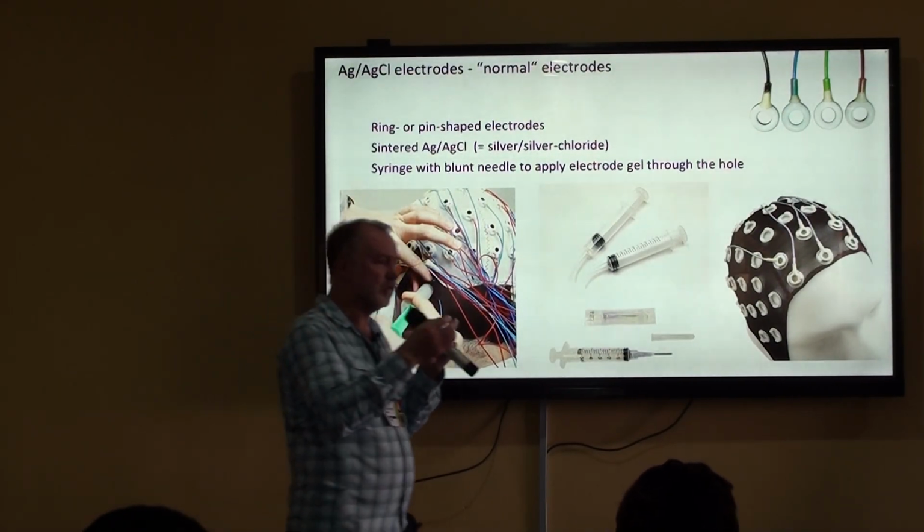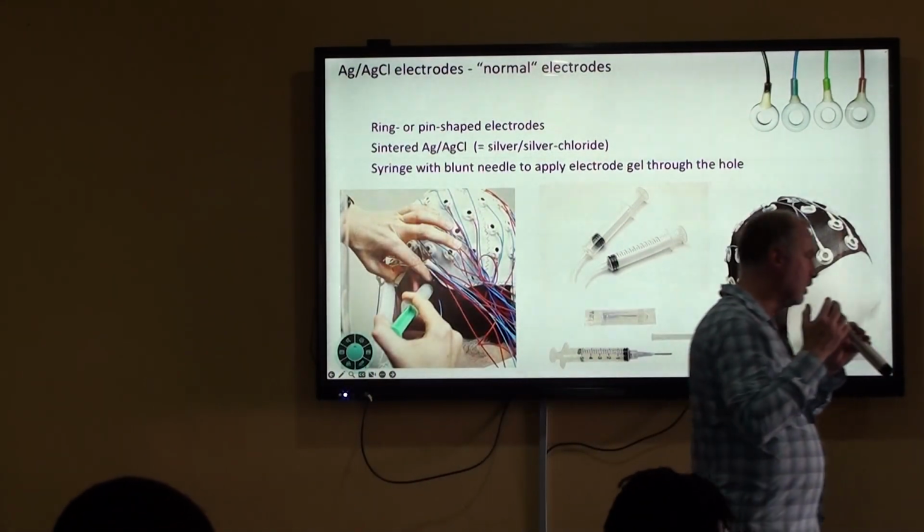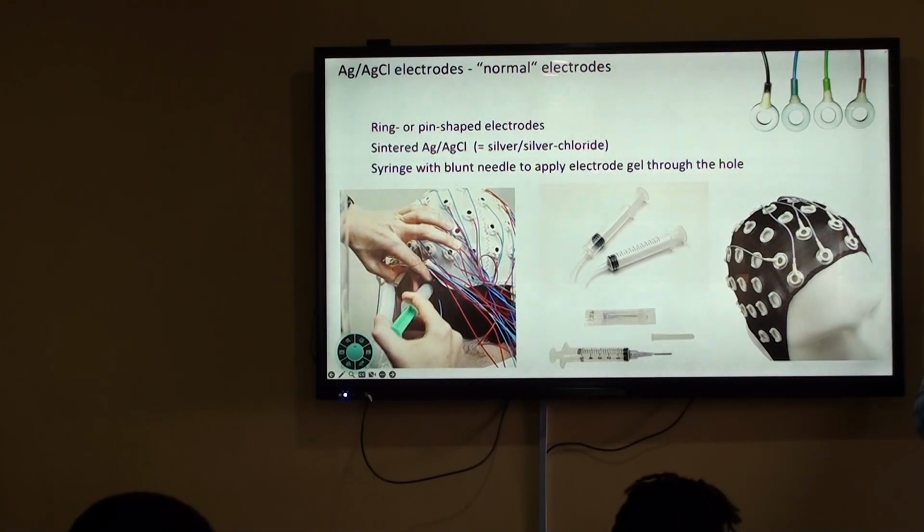So about the size of the caps, you mean? Yes, the design. I'm not sure whether there are specifically African design caps. I'm also not really sure whether there are differences in head dimensions between Africans and Europeans. I know that there are special caps for Asian people. Asian people tend to have a slightly rounder head, so the European style caps or the Caucasian caps don't fit Asian heads so well.